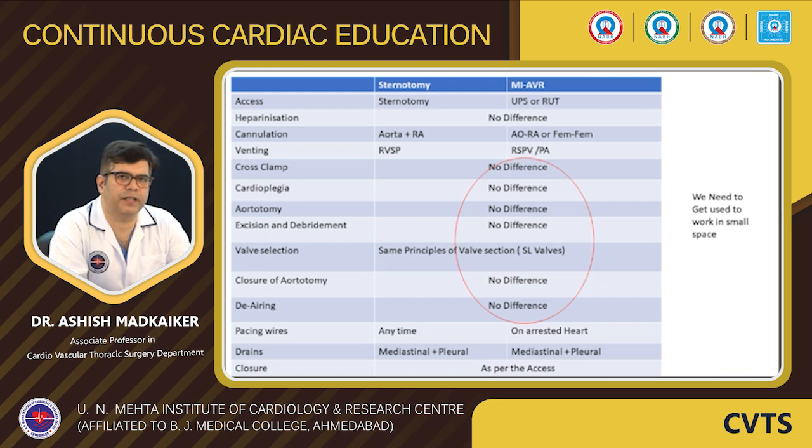Theoretically, there is not much difference, but practically, as we know, minimally invasive is going to be more challenging. We should not forget to put pacing wires on the arrested heart, because once the heart gets beating, it is very difficult to put pacing wires in minimally invasive cardiac surgeries, and drains as per the requirements. So basically, when we are talking about minimally invasive, we need to get used to working in small spaces, and it's a long learning curve, but the end results are very rewarding.